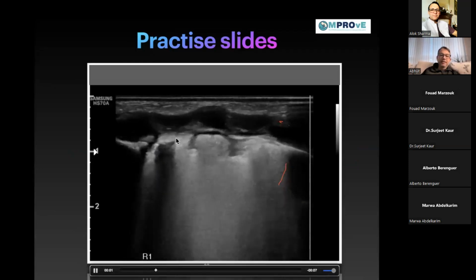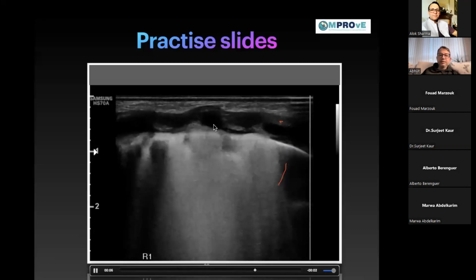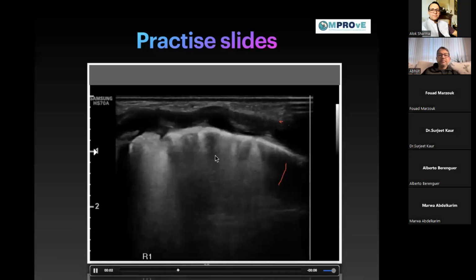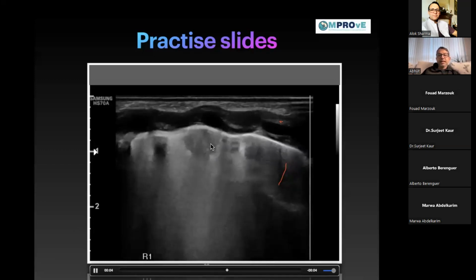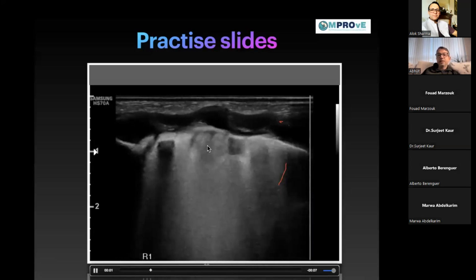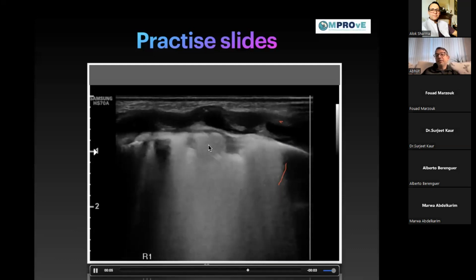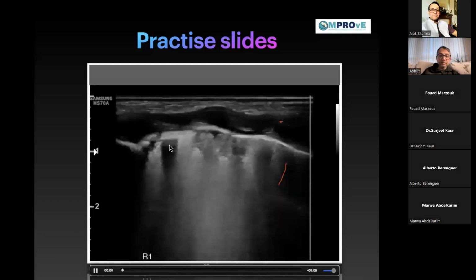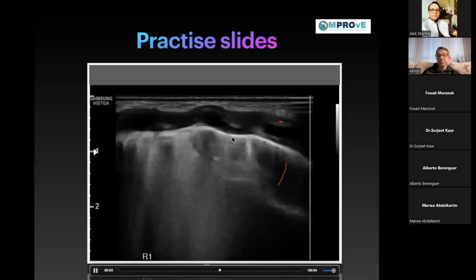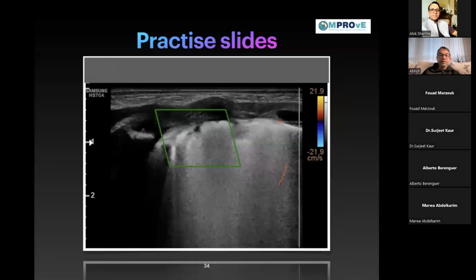Okay, and then you can see the B lines, which have become compacted. I don't have to tell you, there's something wrong going on in this segment of the lung. There is an anechoic area coming into the picture, looks more like a lobe or a tissue-like sign there. But then I don't know, it might be just a collapsed area. But it looks like a broken pleural line, or it could be a fractal sign, irregular borders there. What do we do?